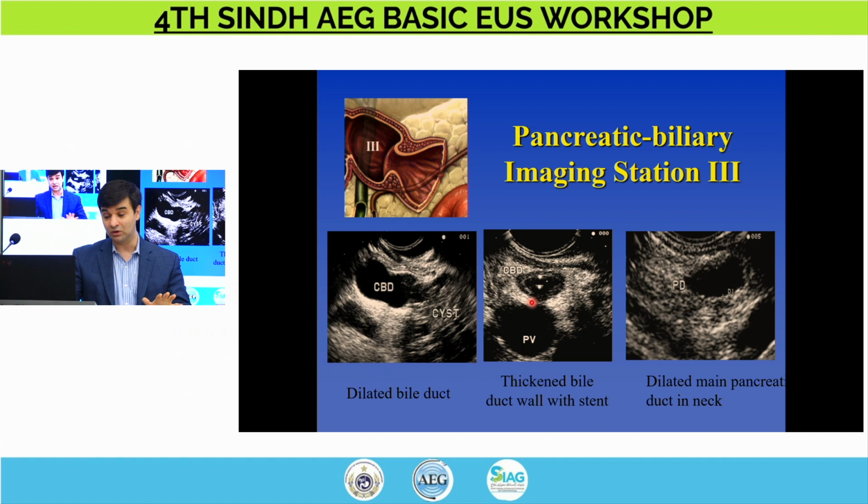Learn to identify foreign bodies. These are very helpful. So a patient with a stent in the bile duct, you're trying to evaluate, is this a bile duct, is this an artery located in the area, oh, my Doppler is not working. Learn to identify what a stent looks like, and a stent looks like two little white dots with black inside. And those dots is what you can track up and down in the bile duct, and they help you sort of orient yourself. When you have a pancreatic stent, use that as a guide to evaluate the entire organ when you come across those patients.